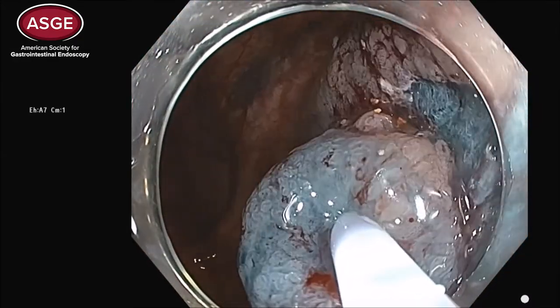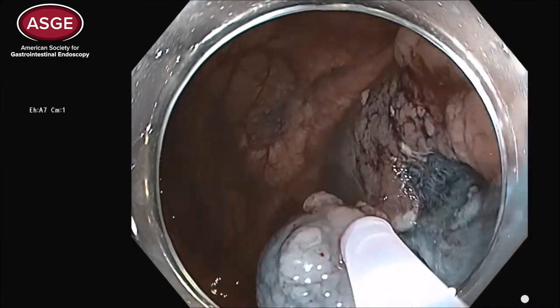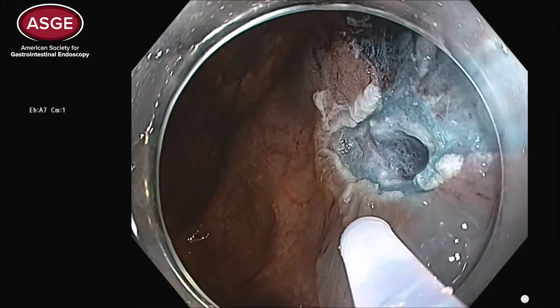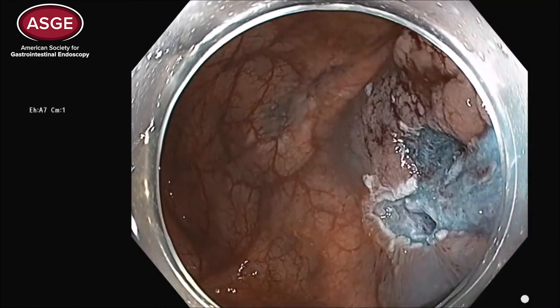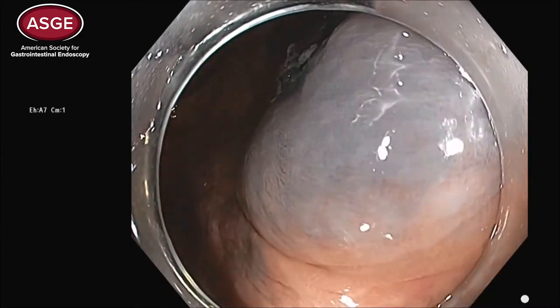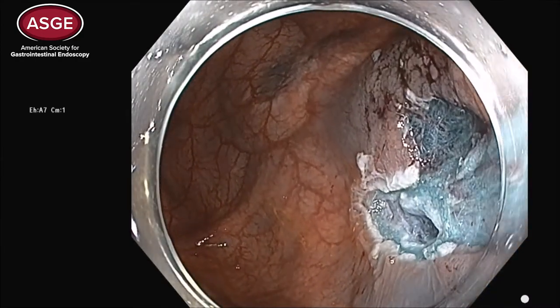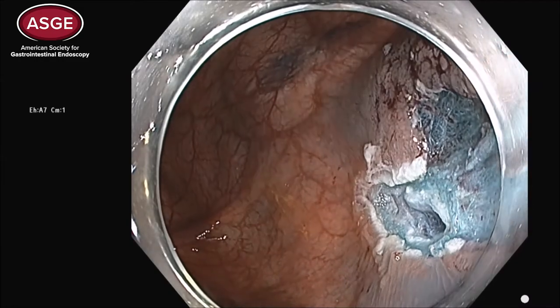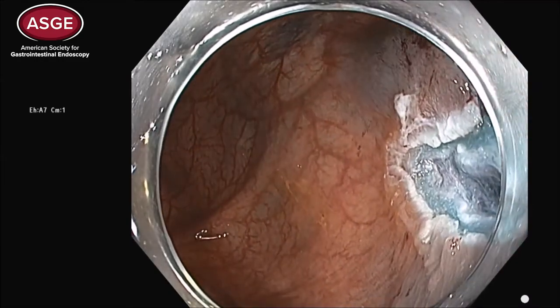Part of the lesion has not been removed yet. We're about to move this section off of the defect, and in the defect you can see an area with some depression and a couple of white bands along the top of the depression. The question is: what has happened during this EMR, if anything?